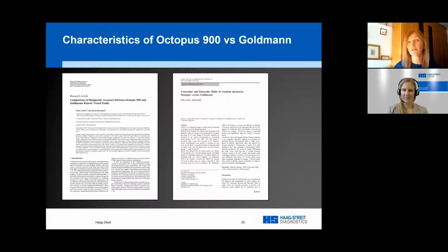Early on for Octopus, I used to use the freehand mode from time to time, but very, very quickly I was using the semi-kinetic mode for most patients. I've not used the freehand mode now for a long time. I think the last time I used it was for a patient who had functional visual field loss. So it was really, really useful to do the spiral field freehand.